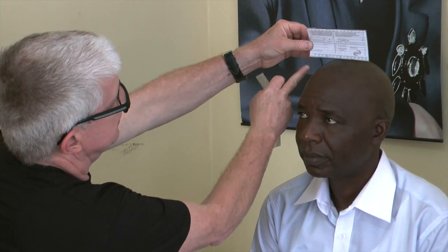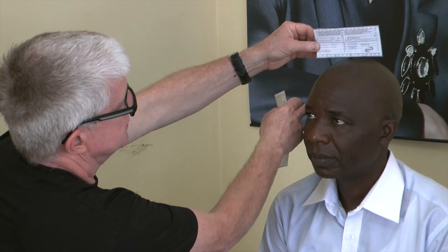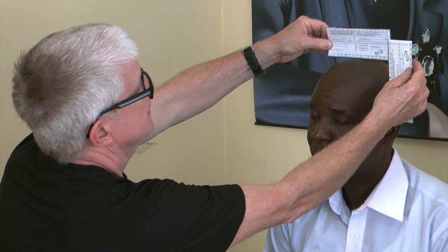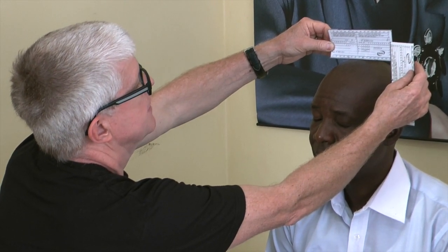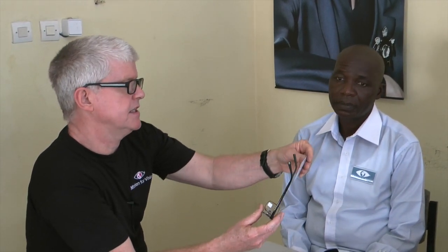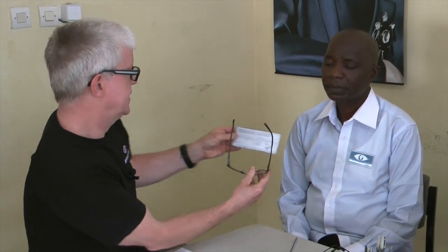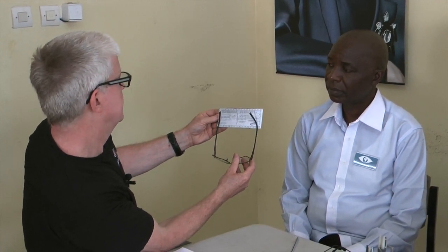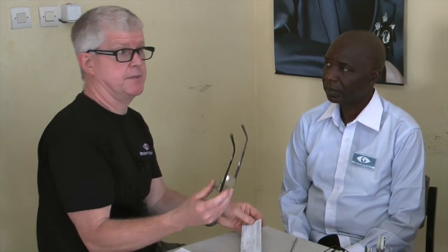You place one ruler with a zero where you feel corresponds to the outer part of the head at this side, and then you use the other ruler and just drop it perpendicularly. The measurement for Remy is 150, so it's about 150 millimeters. You want the distance between the sides to be 150 to correspond to that. If you place the sides on top of the ruler, you'll see that the distance between those two is about 140, which is not bad — the frame is actually fairly good.